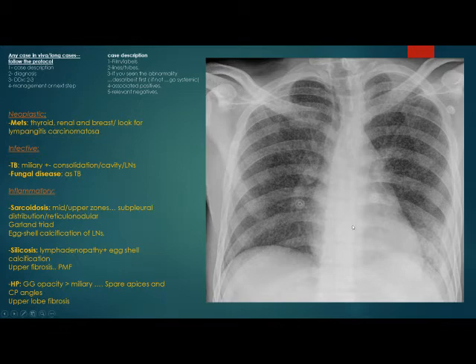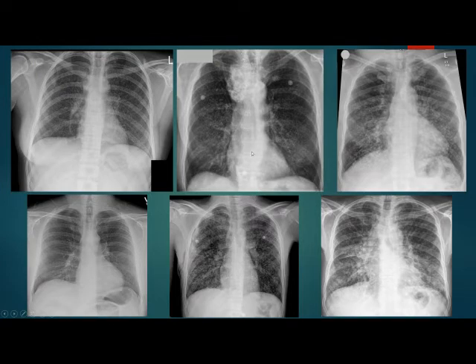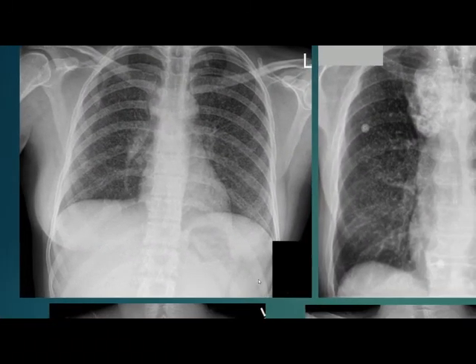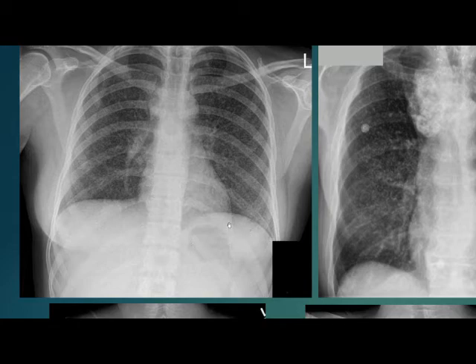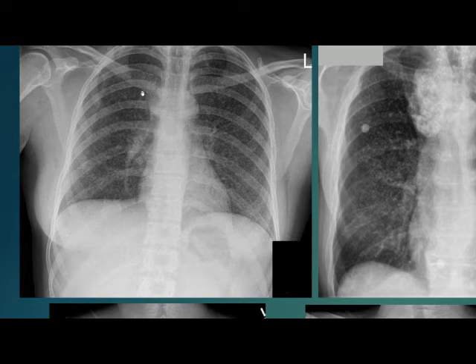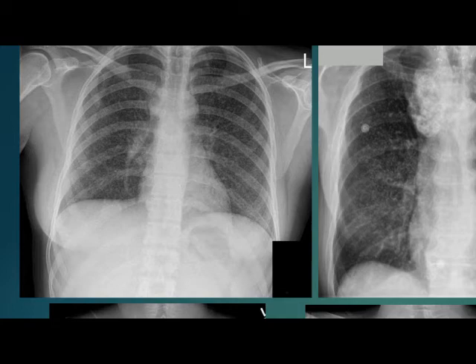Now let us see some examples. In this first image, we can see the miliary pattern. There is a mastectomy of the left breast. There are no axillary clips seen, but there are paratracheal lymph nodes. So the primary diagnosis should be metastasis from breast carcinoma. However, it also depends on the patient's clinical history — if the patient presents very ill with symptoms like night sweating, tuberculosis could still be a possibility.